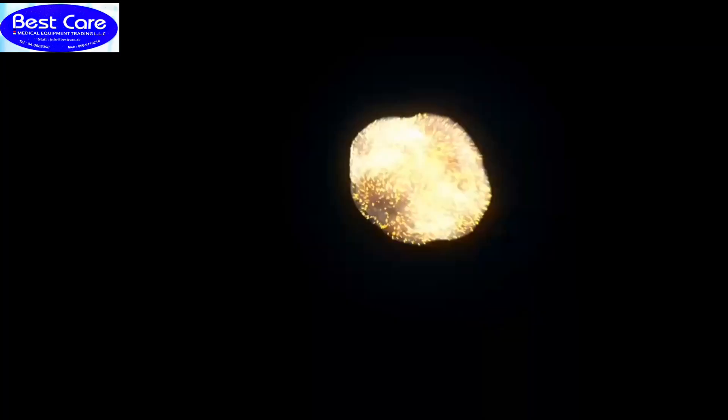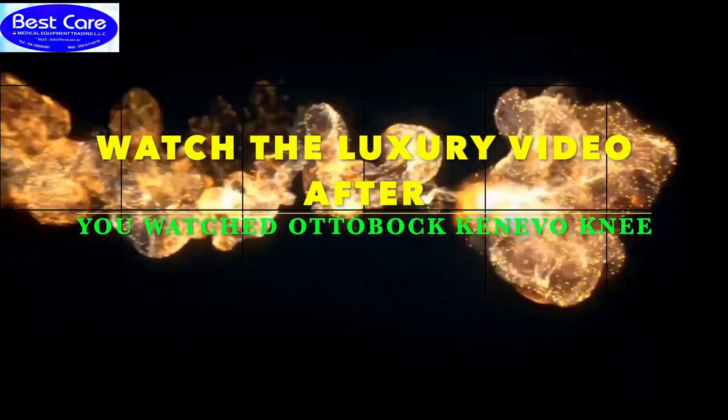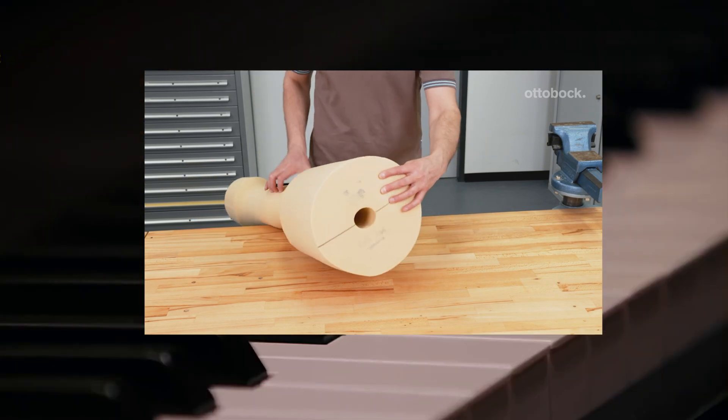Welcome back to Best Care Forum. The Kenevo knee joint is now compatible with a cosmetic foam cover.